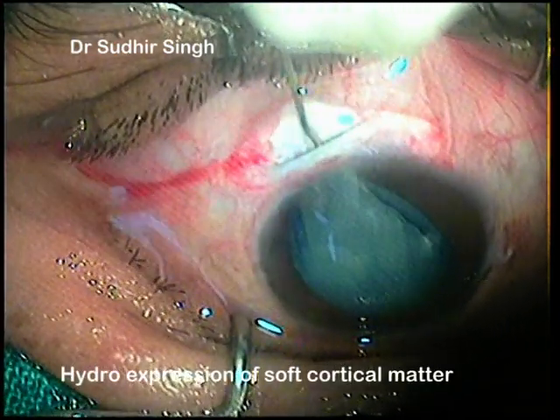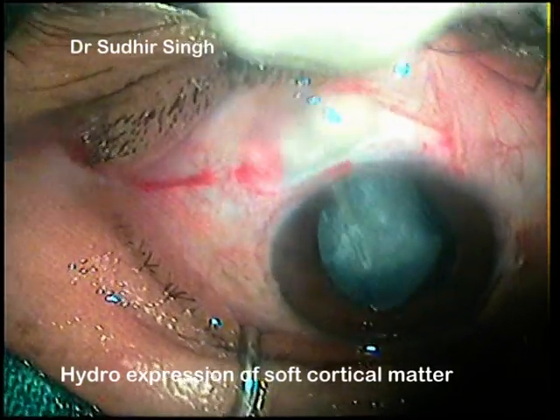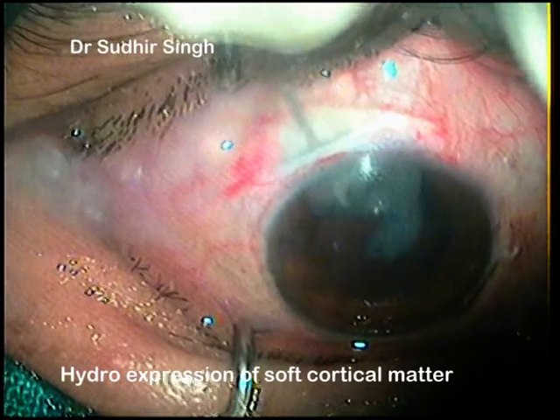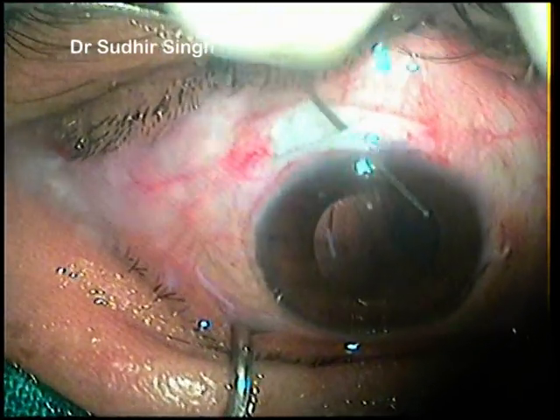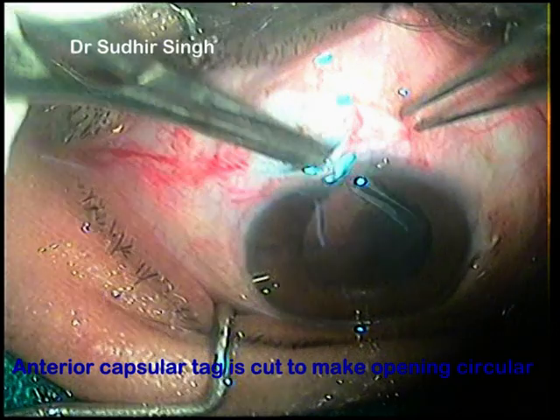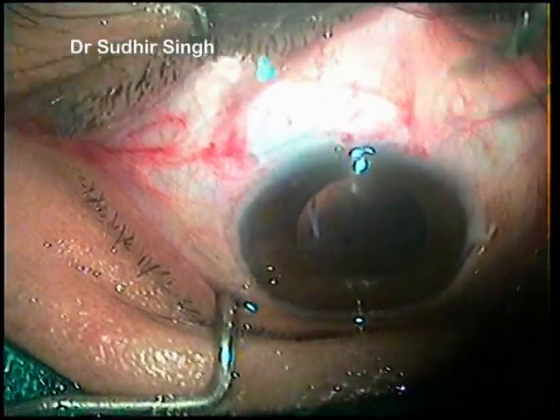The lens matter was expressed out by hydrojet, as this was a very soft cataract. If it were a hard nucleus, it could be managed by manual small incision cataract surgery. The anterior chamber was filled with viscoelastics, remaining anterior capsule tags were removed, the PMMA IOL was implanted in the bag, and the anterior chamber was cleaned with an irrigation-aspiration cannula.